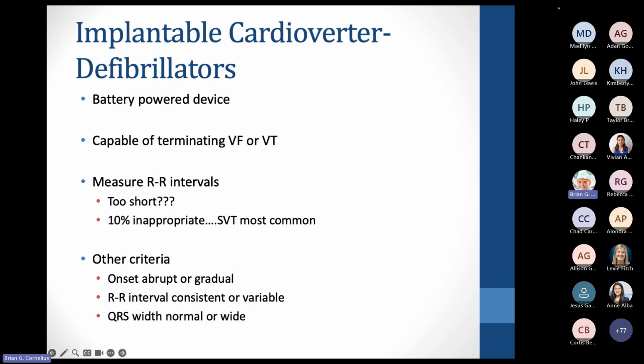The other thing is they may fail, or they may not work quite the way you want them to. So if you have a patient that's in VFib or VTach, even if they have an AICD in place, go ahead and defibrillate them if it doesn't work. It's very unnerving while you sit there and wait on the device to work. But just be cautious at the same time that you've either turned the device off or you know what's going to happen. Sometimes what you'll see is that the reason they're in VFib or VTach is because the device isn't working. So just be mindful of that.